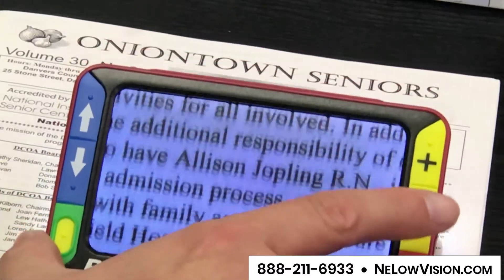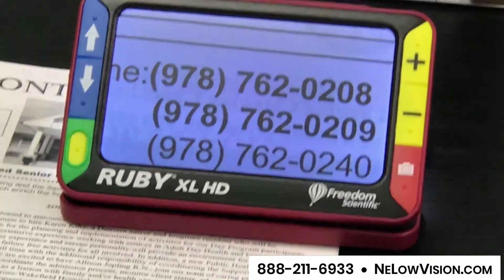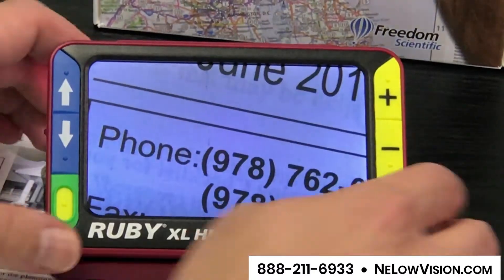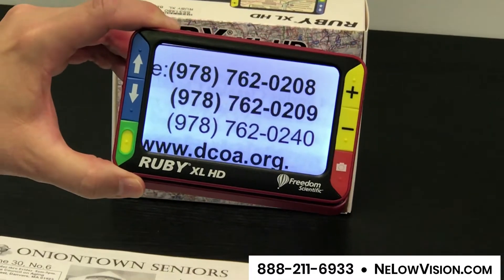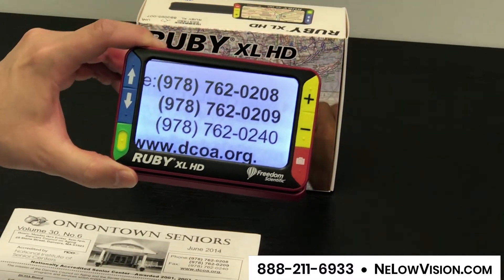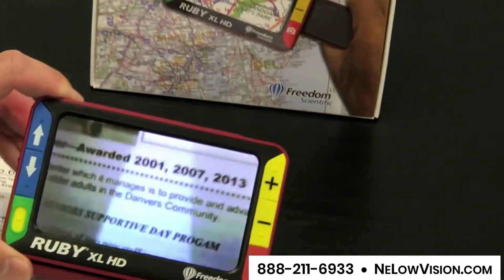If you're looking at a phone number, you can get that on screen and press the button at the bottom to save that image. Now I'm able to move around the house and still have that number on screen. All I have to do is press that same button and it goes back to a live image.